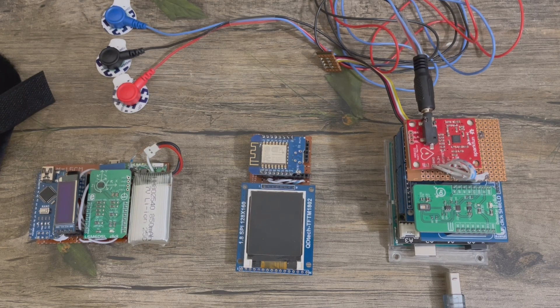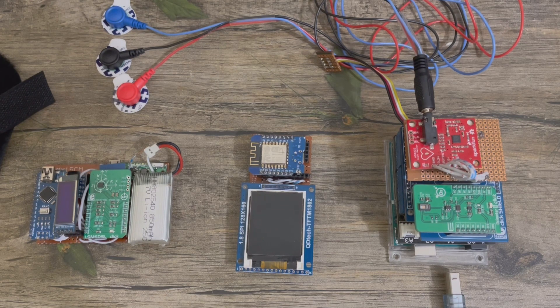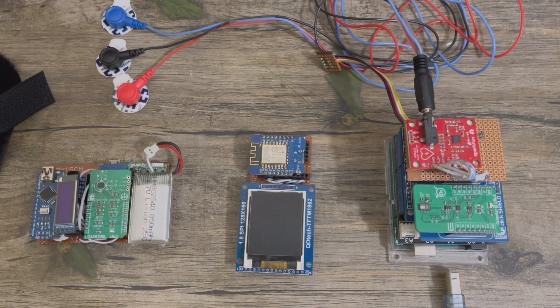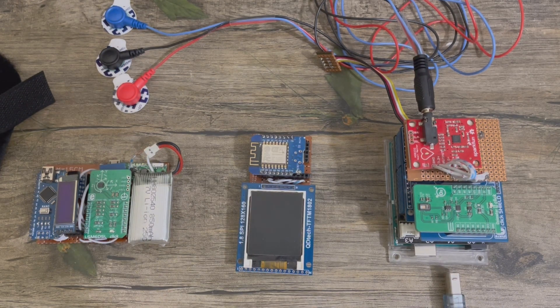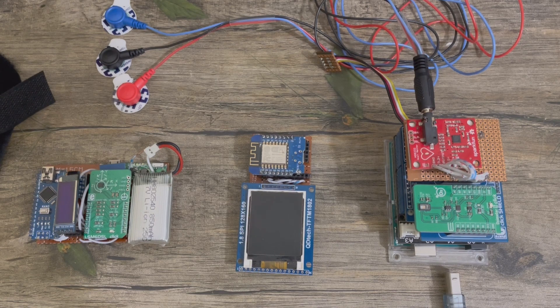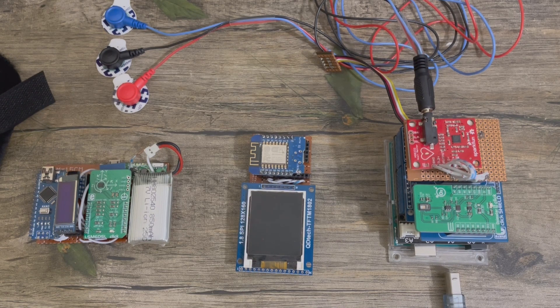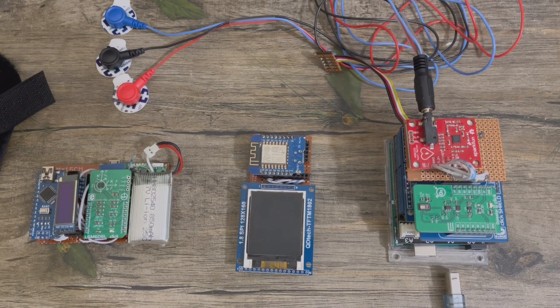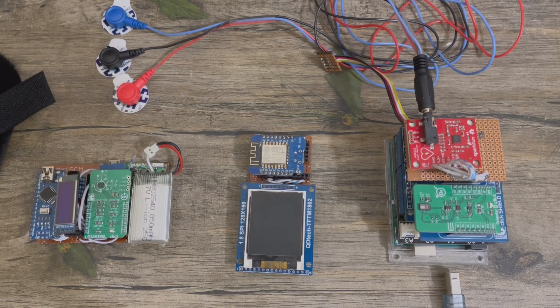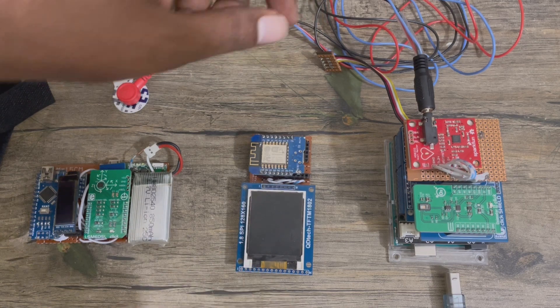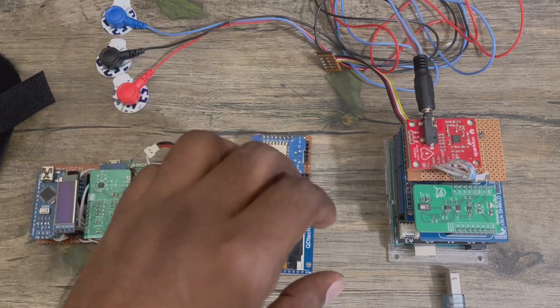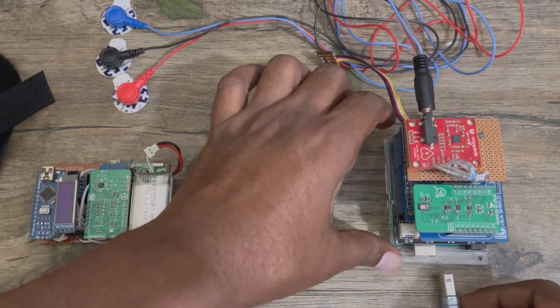Let's connect all the system, then I can check whether it's working or not. First, let's power it.